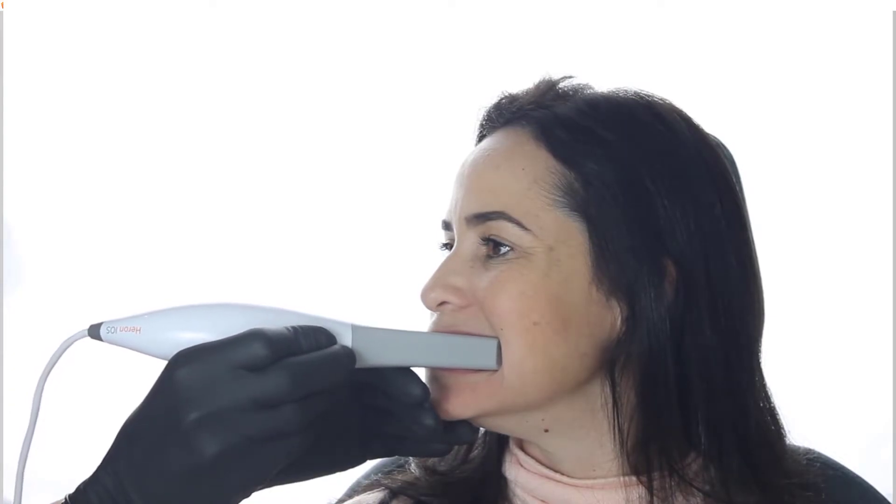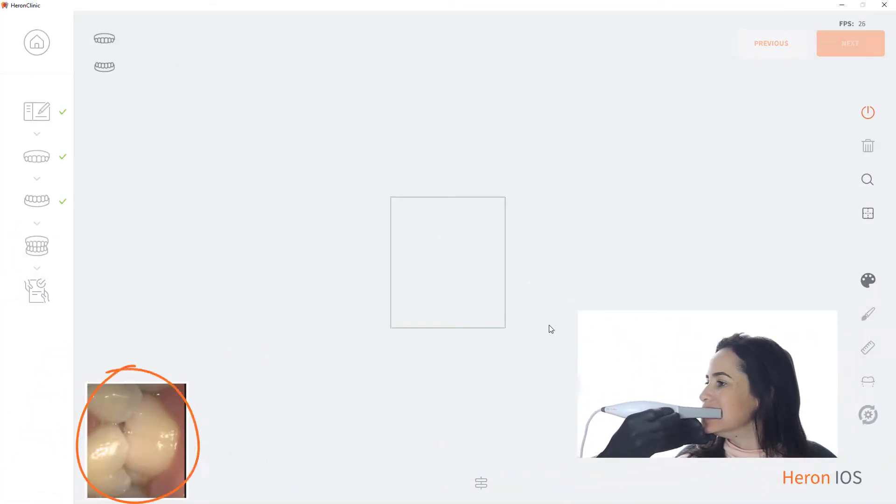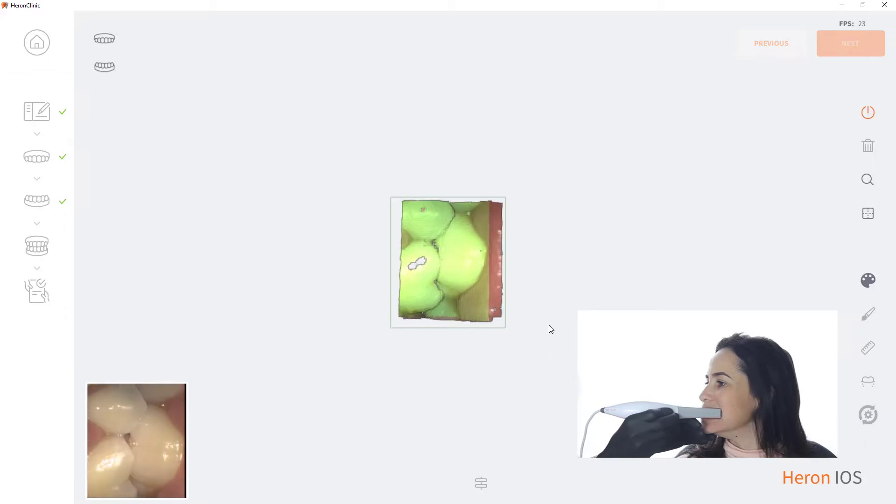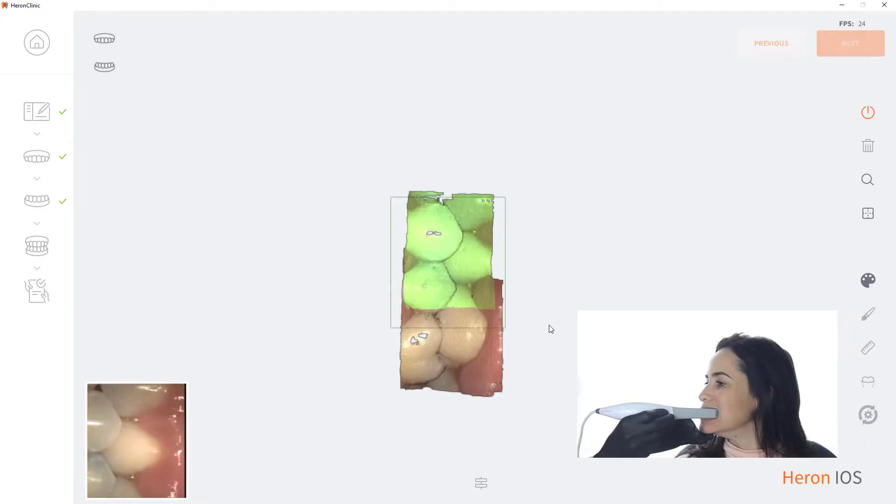Press the start button and make sure you see the occlusal line in the middle of the scanning window. The scanner performs at its best when scanning in straight lines, while turns are more challenging. Hover four teeth on a straight line from the back to the front.